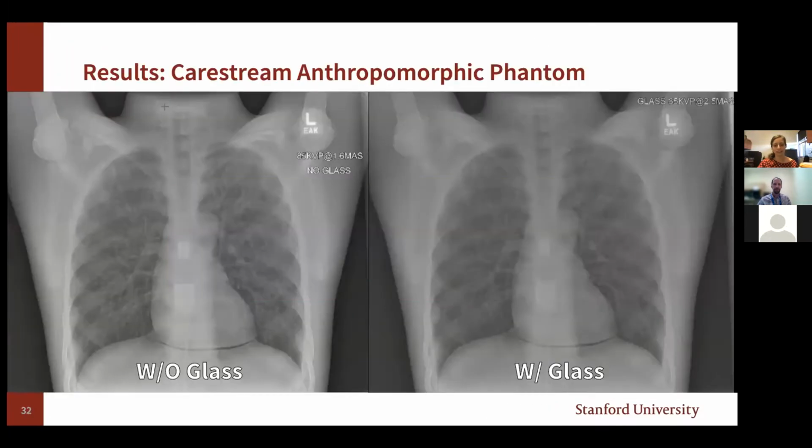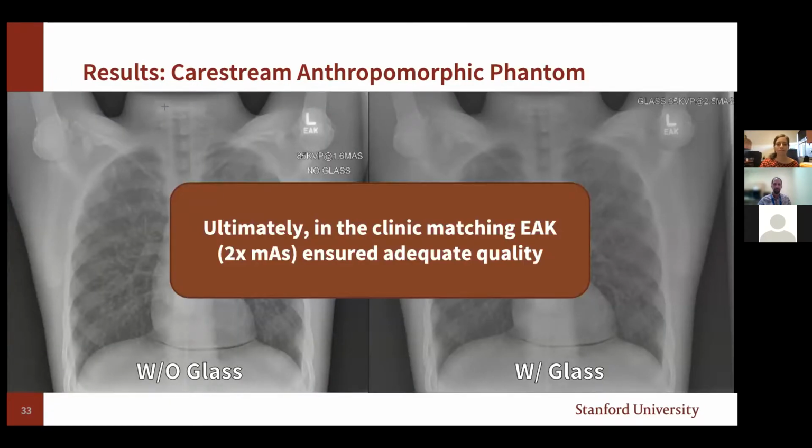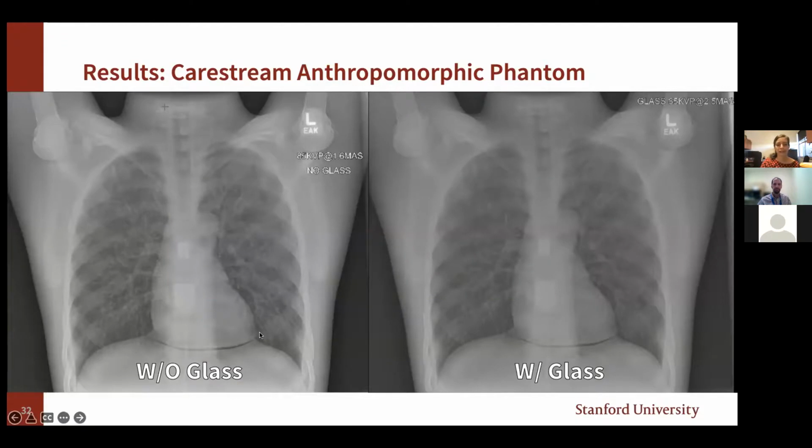Yeah, if you look at these images, you're looking for a subtle cloudiness, which indicates, oh shoot, I don't have the clinical images in this presentation. But you're looking for opacities and things like that. So the scatter does reduce your contrast to noise ratio, particularly in larger patients, which is part of why we had to up our technique. But we were also getting grid cutoff because you're at an extended SID. And again, it's about matching the grid to the X-ray tube. That would probably be a worse detriment to the image quality than the actual scatter, I bet.